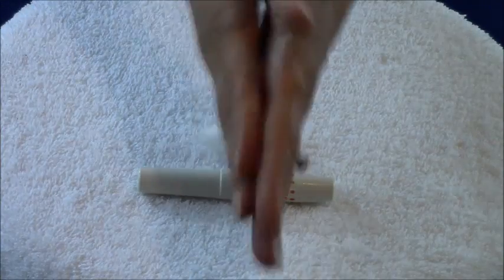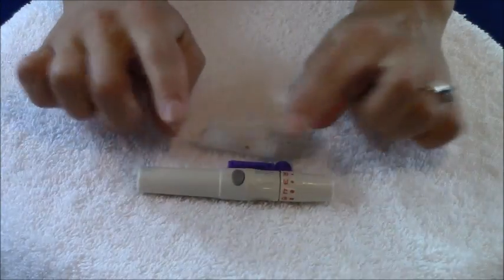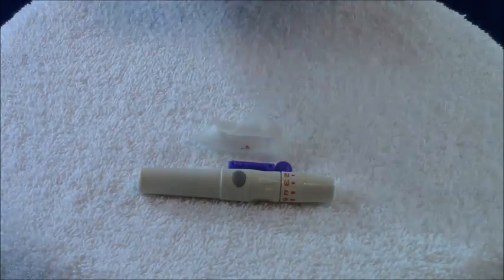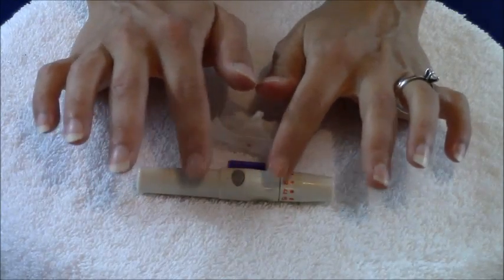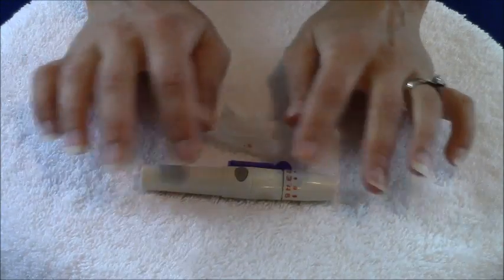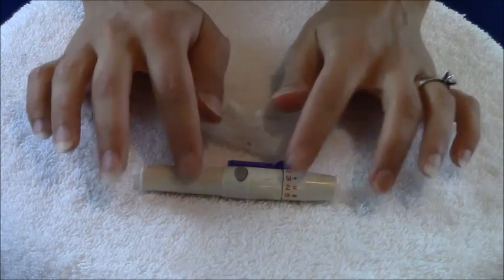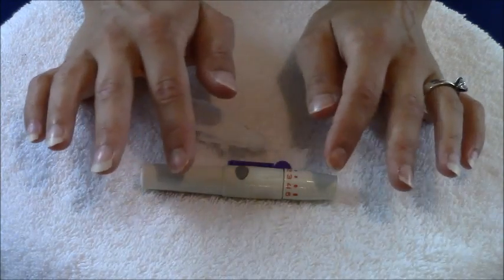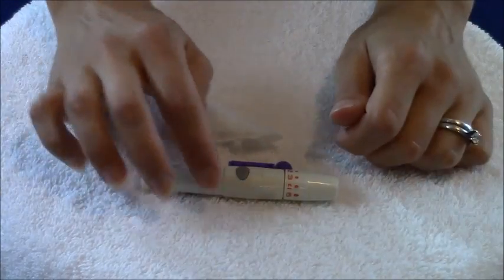The very first thing you want to do is wash your hands. Then get your lancet device primed and ready to go. In the hospital setting, lancet devices will typically already be primed for you, but if you've got your own testing kit you will need to prime your own lancet.